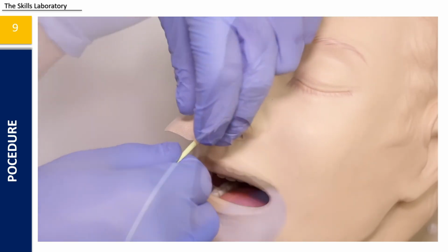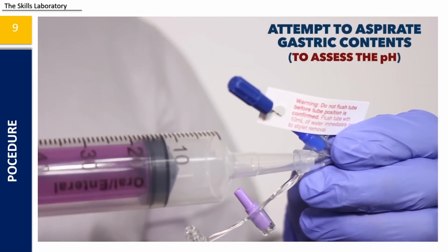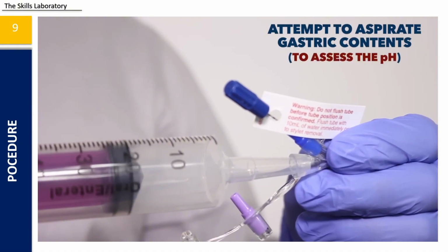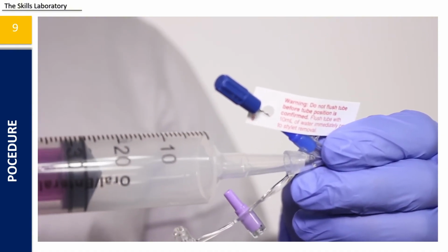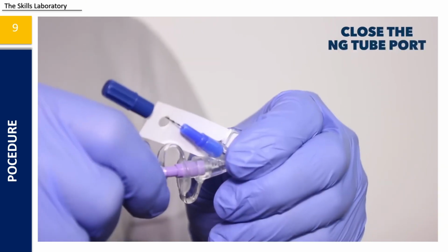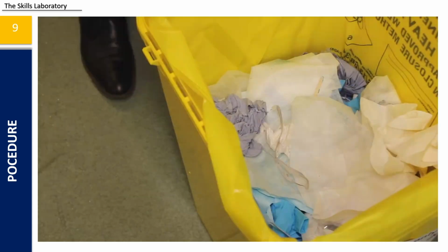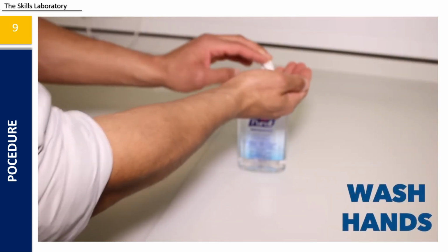The insufflation of the air, and if this is correct, you check for... okay, it's just the reverse for them. They secured it before testing for the pH test. However, in the common setting in our hospital, we just use the auscultation method.